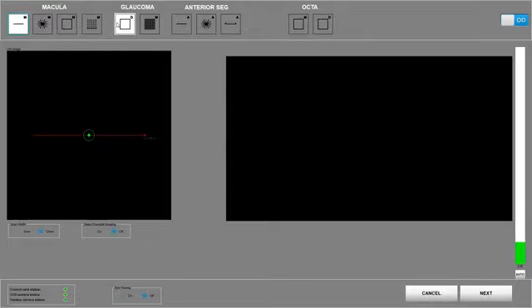There is also the glaucoma panel, the glaucoma optic disc, the glaucoma macular cube, which is practically the ganglion cells, and you can move on to the anterior segment scans, which are anterior HD line, the corneal 6 radial line, and finally the angle-to-angle scan.